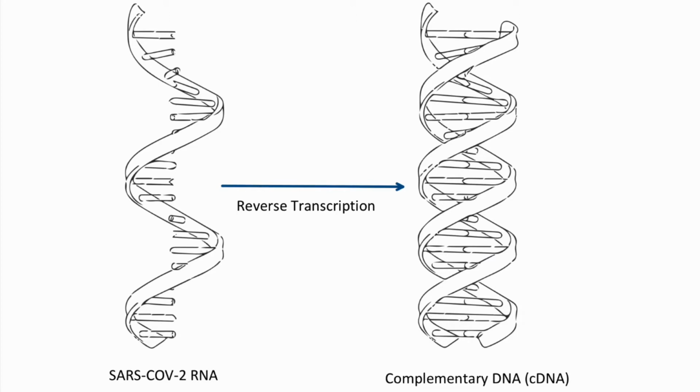As mentioned previously, SARS-CoV-2 is an RNA virus, and PCR only works if there is DNA, so it can amplify DNA only.